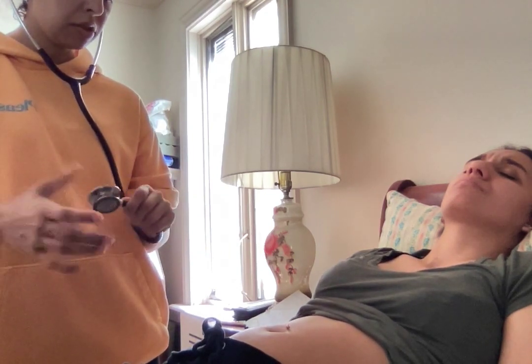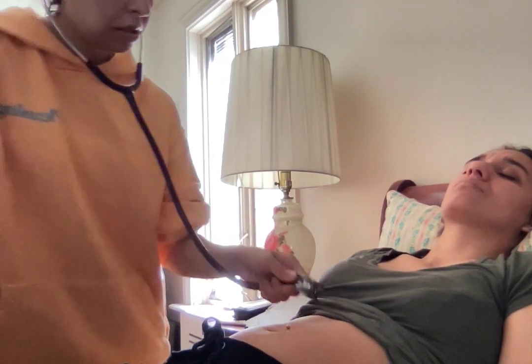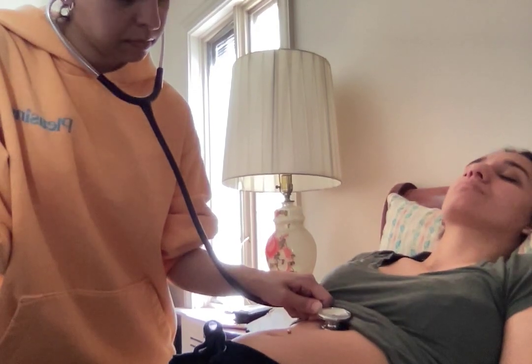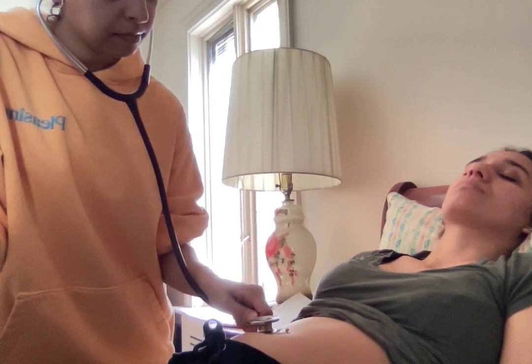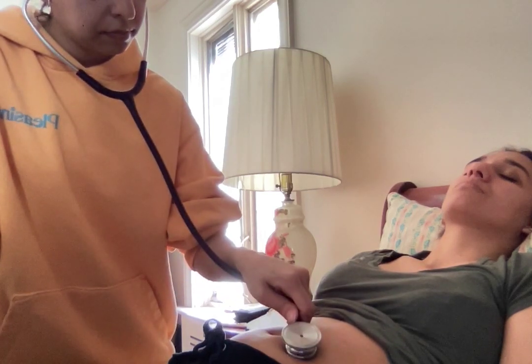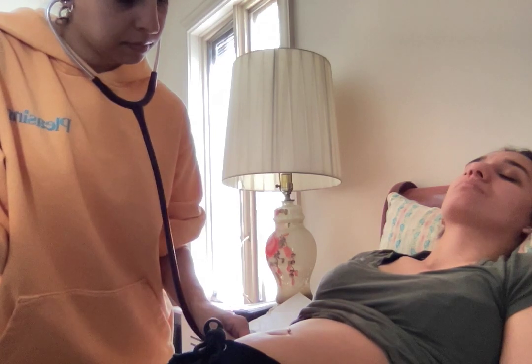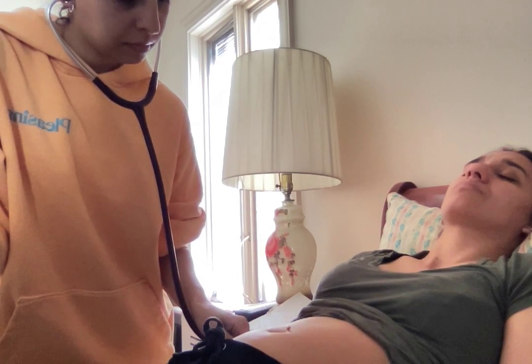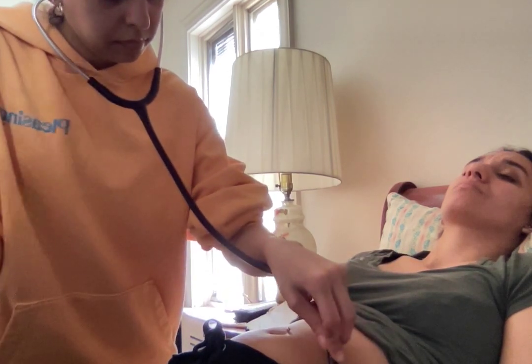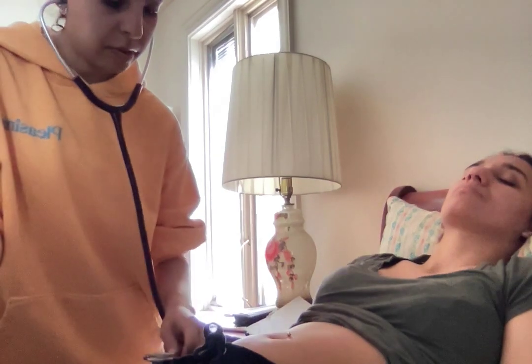I'm going to switch over to my bell and listen to your arteries for any bruit, starting with the aorta, iliac, renal, and then your femoral.